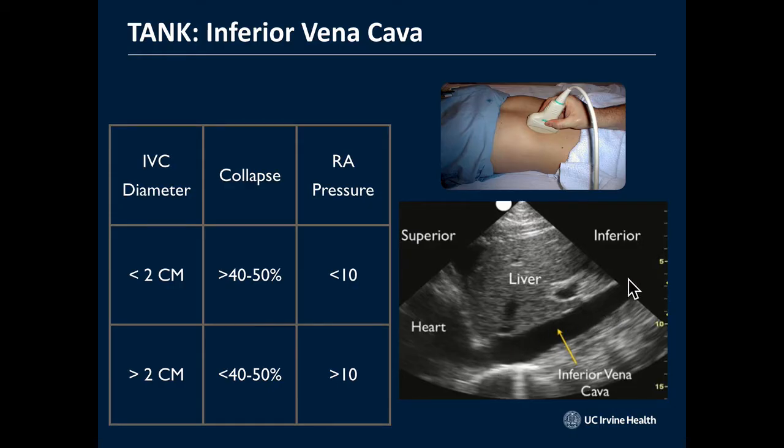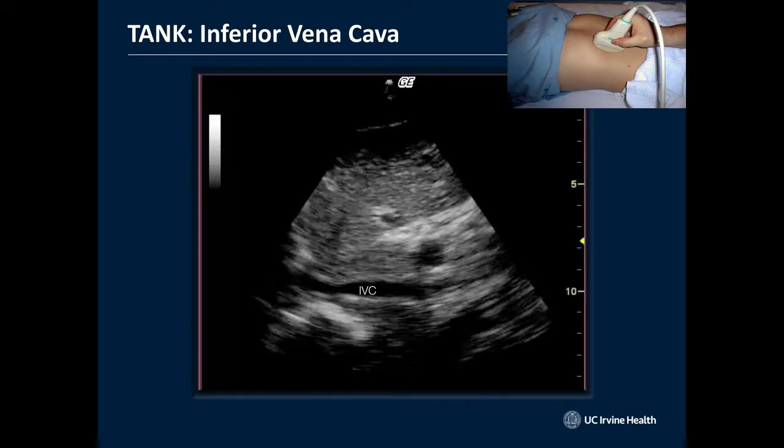They take a deep breath, and the IVC is dumping into the right atrium of the heart. You take that curvilinear transducer and move it parasagittal right, meaning you're in a sagittal plane but off to the patient's right, where you would expect the IVC to be. I push down really hard, I'm not going to lie. Sometimes I use two hands, and I drag the probe right up underneath the rib cage and angle it back, looking up towards where the RA is, where the IVC jumps into the RA, and that's where I'm going to see it.